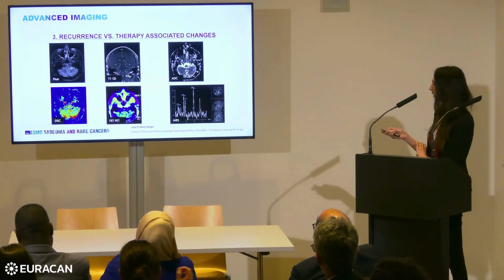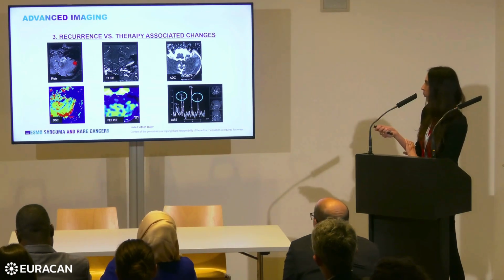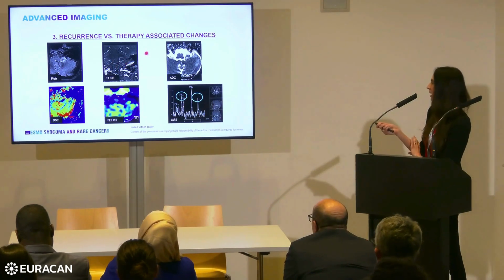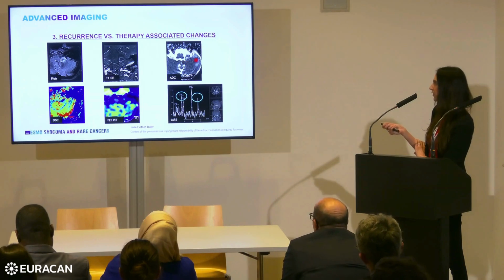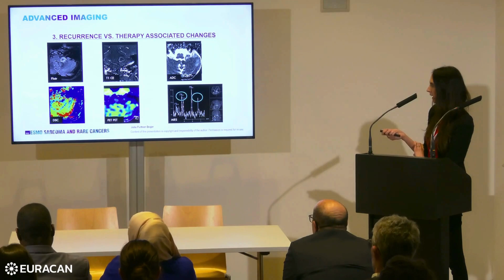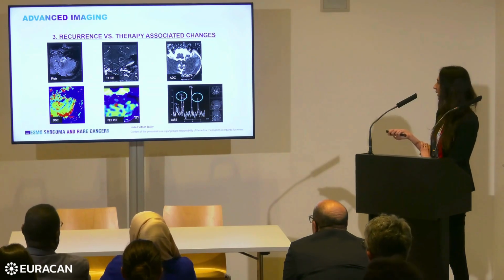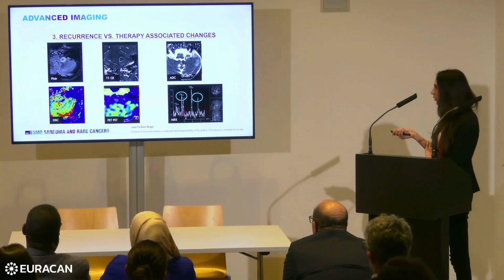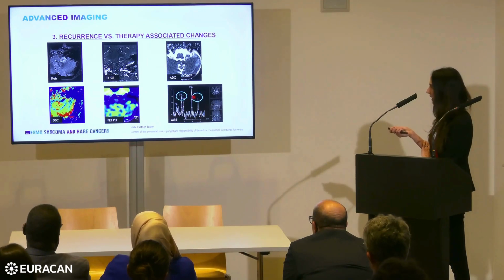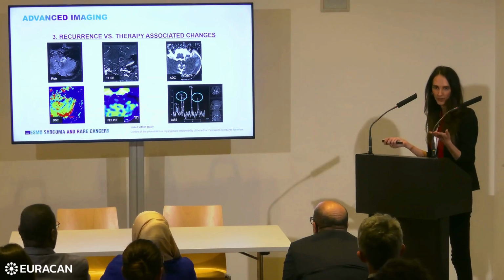So coming back to our case. We saw this lesion. It was increasing in size, with a new contrast enhancement, but there was no diffusion restriction, there was no increase in perfusion, and there was no increase of amino acid uptake. And in the MR spectroscopy, you can see a moderate choline peak, but a very high lipid-lactate peak representing the cell death of this lesion.